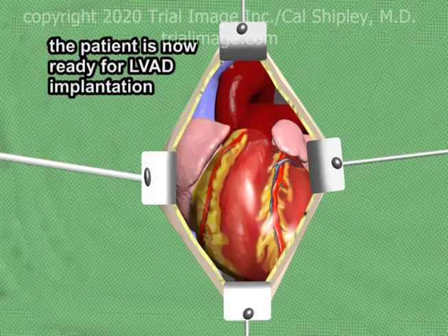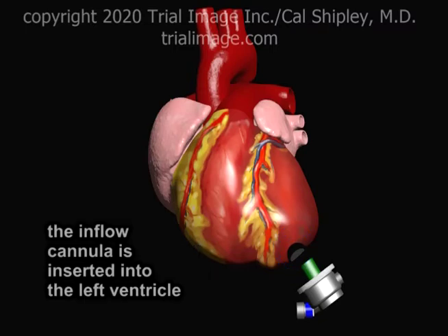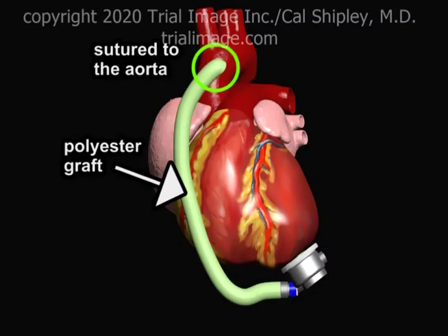Once the patient has been safely placed on cardiopulmonary bypass and the heartbeat has been stopped with cardioplegics, the implantation procedure for the LVAD may proceed. The surgeon uses a specialized coring tool to create a tunnel through the wall of the left ventricle at its apex. The inflow cannula of the pump is then inserted through the tunnel into the left ventricle. The collar of the LVAD pump is affixed to the left ventricle with a series of sutures. A grafting tube, typically made of polyester, is attached to the LVAD pump and sutured to the ascending aorta.